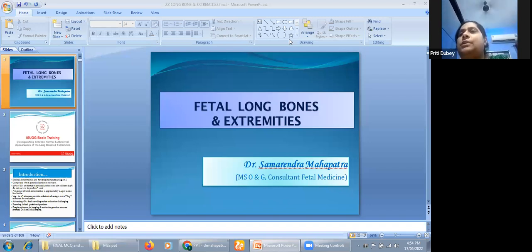So that is very important. Whenever you have an opportunity to see the baby in the first trimester, please see all the 3 segments very well. And the rest of the anomaly scan, Samrendra has covered very extensively. It was a beautiful presentation. I don't think I need to add any point.